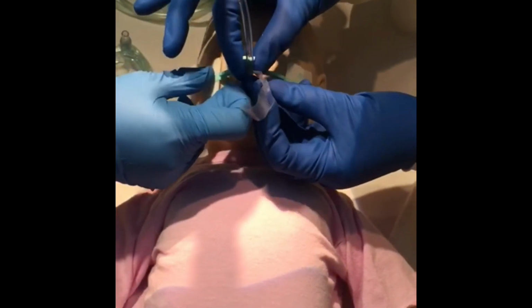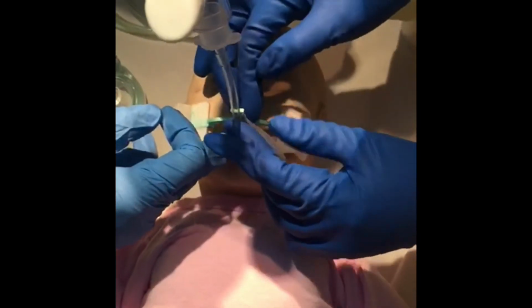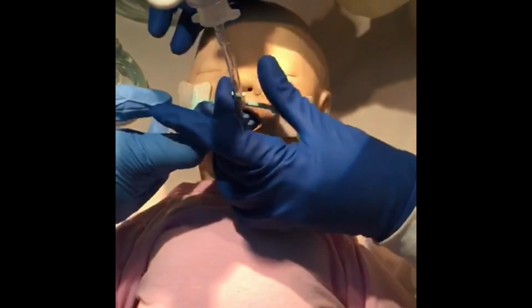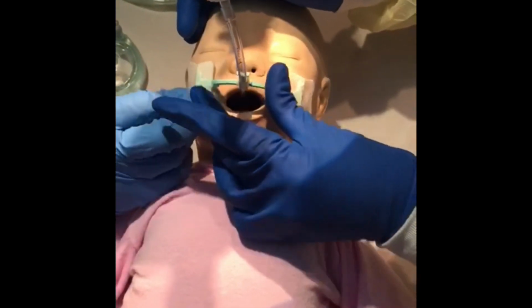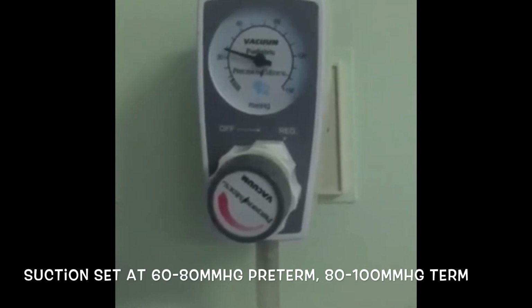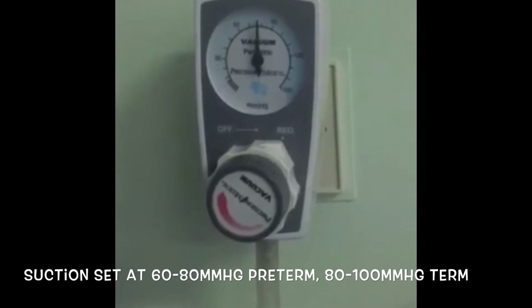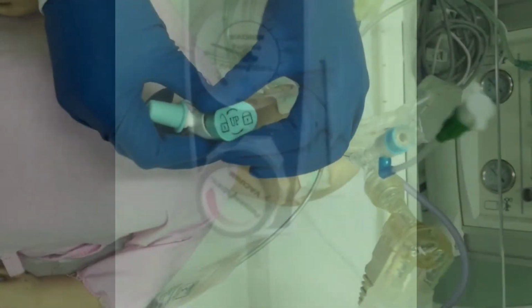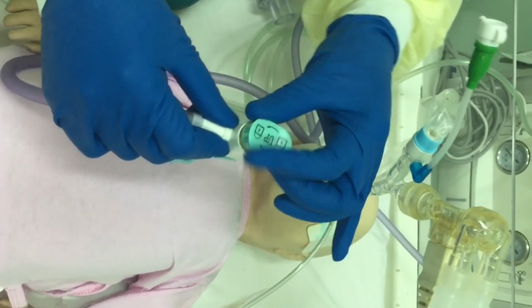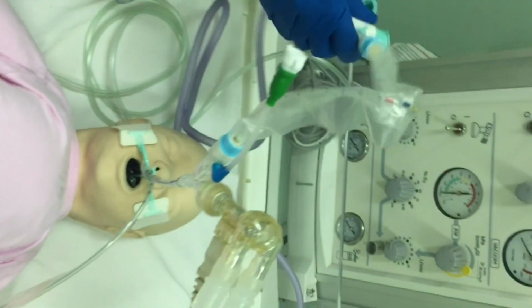Ensure that the plaster site is free of redness or excoriation. Utilize Neobar or Leukoplast to secure the endotracheal tube. We have to verify that the suction is set to 80 to 100 mmHg for term, and 60 to 80 mmHg for preterm less than 1,000 grams. Note that an inline suction system must be used for patients on high frequency.